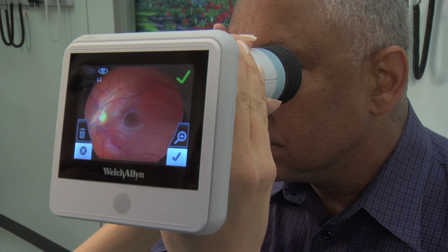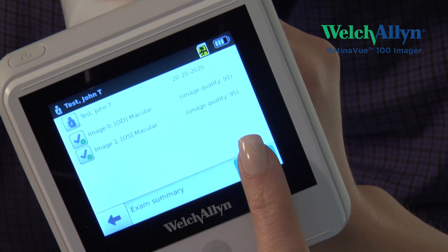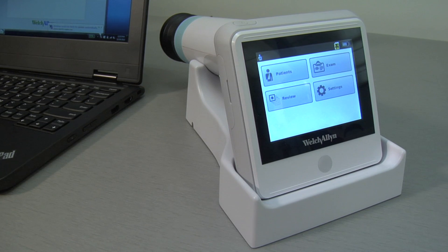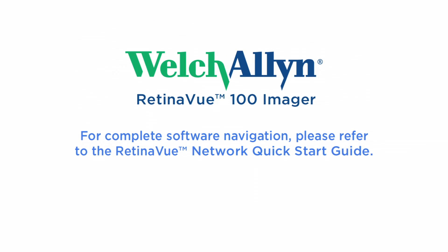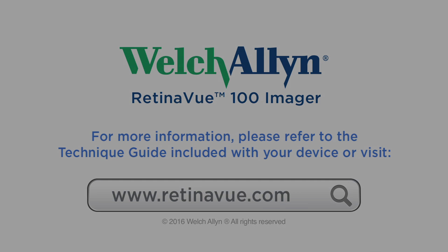Once the left eye is successfully imaged, tap the Accept checkmark. You will then see the Exam Summary screen — tap Save and your exam will be saved to the RV100. Place the RV100 on the docking station connected to a PC running the RetinaVue Network software; the exam is now ready for transfer. For complete software navigation, please refer to the RetinaVue Network Quick Start Guide.